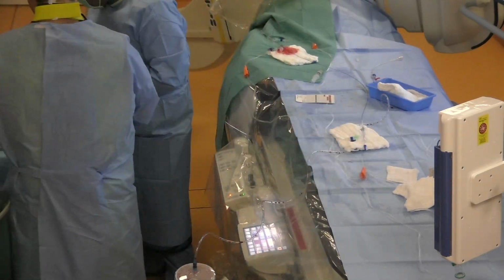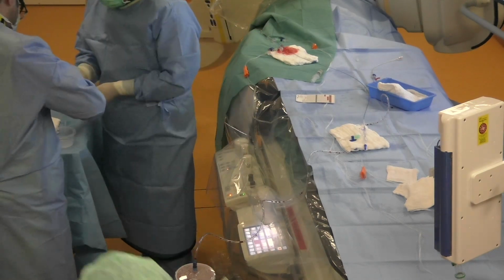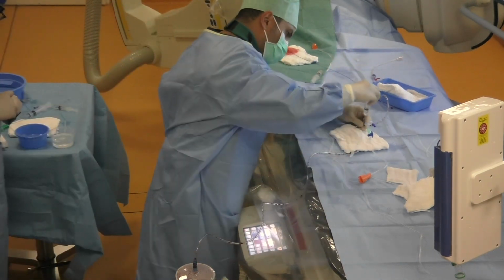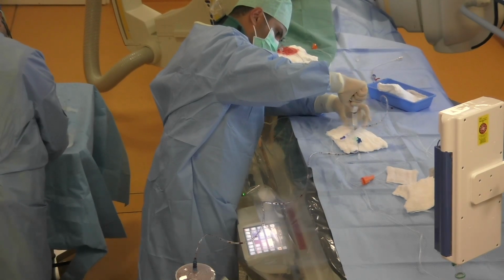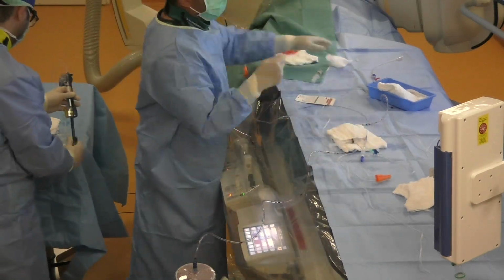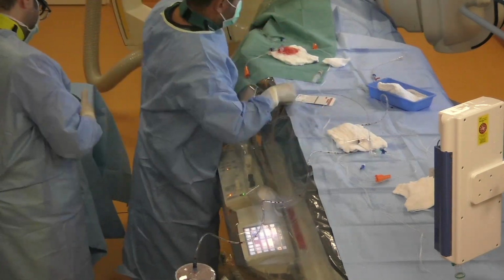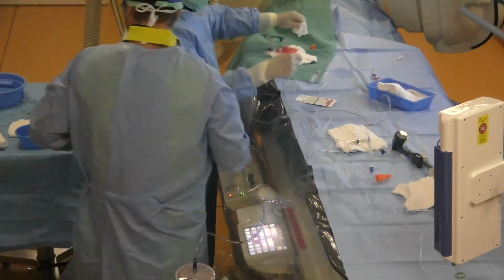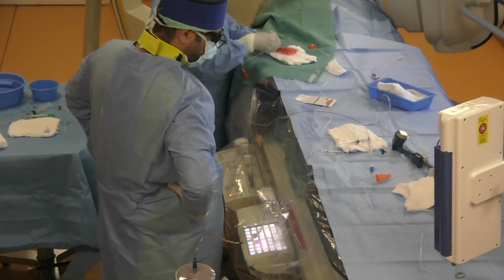And now we remove the air in the balloon with a contrast agent. We attach the syringe to the hub of the balloon and pull it back and knock on the syringe many times to get the leftover bubbles out of the balloon. And now we take the balloon catheter with the microwire and insert them in the aspiration catheter Sofia 5F.